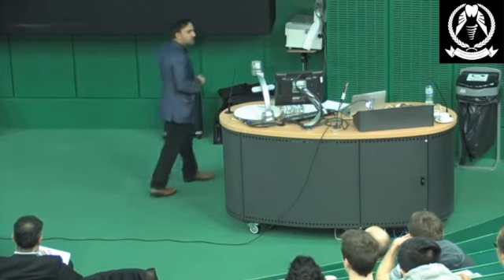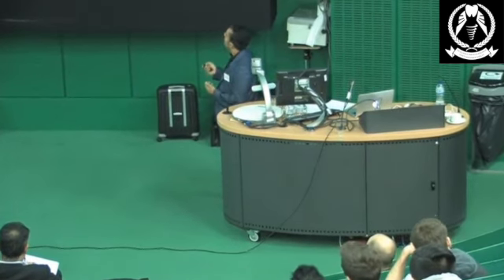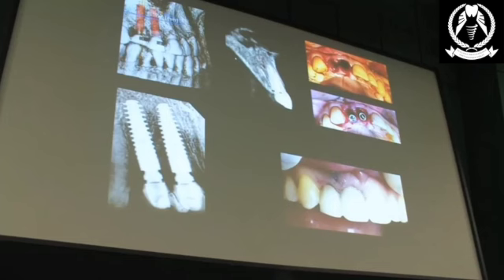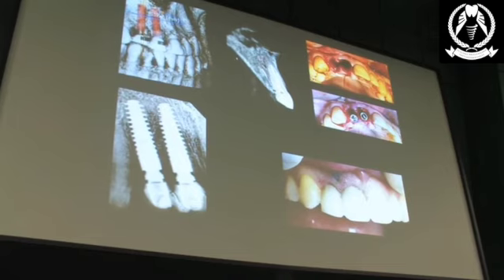Another interesting case. This is a big example of what we do and how immediate placement helps patients. We have a deciduous lateral incisor here, and a failing central incisor with a large root canal, post-crown, and it's cracked. We CT scanned this gentleman and looked at his bone. What I was most interested in was where the central incisor sits within the socket, and this is the thin buccal plate of wall on the outside. Our implant actually goes in palatally, but the head of the implant will still stick out in the right position within the socket, if you get it right and know how to do this.